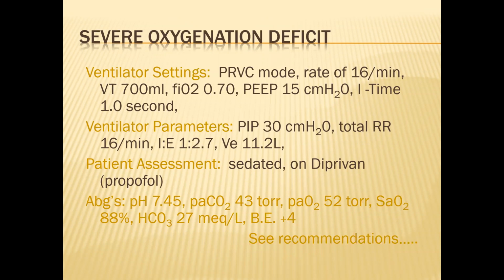Why not go higher than 15? Might impede venous return? No, 15 has been like the highest that you've seen. I've seen it at 10. I've never seen it higher. How high? You have?